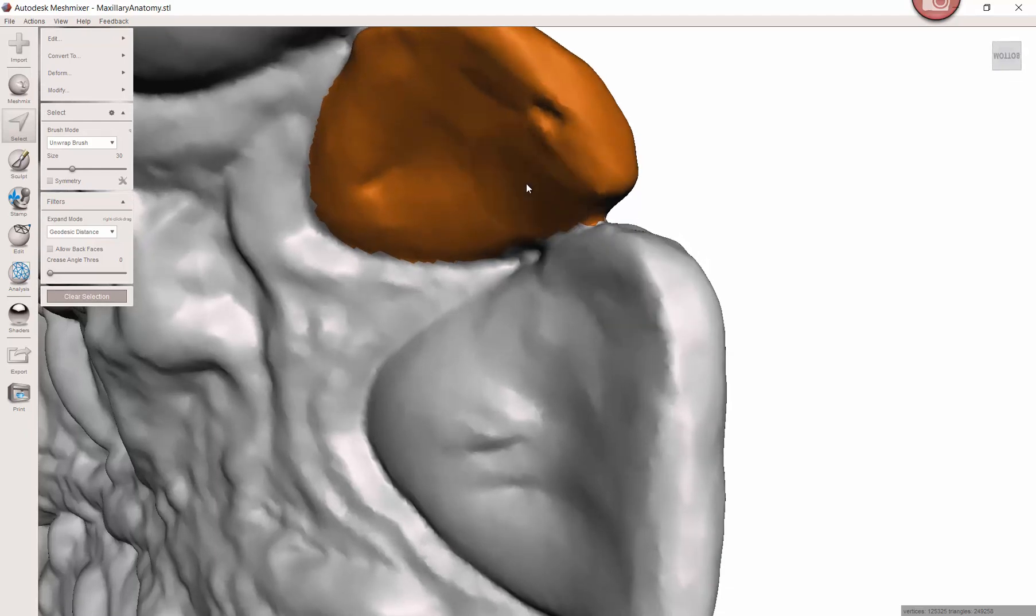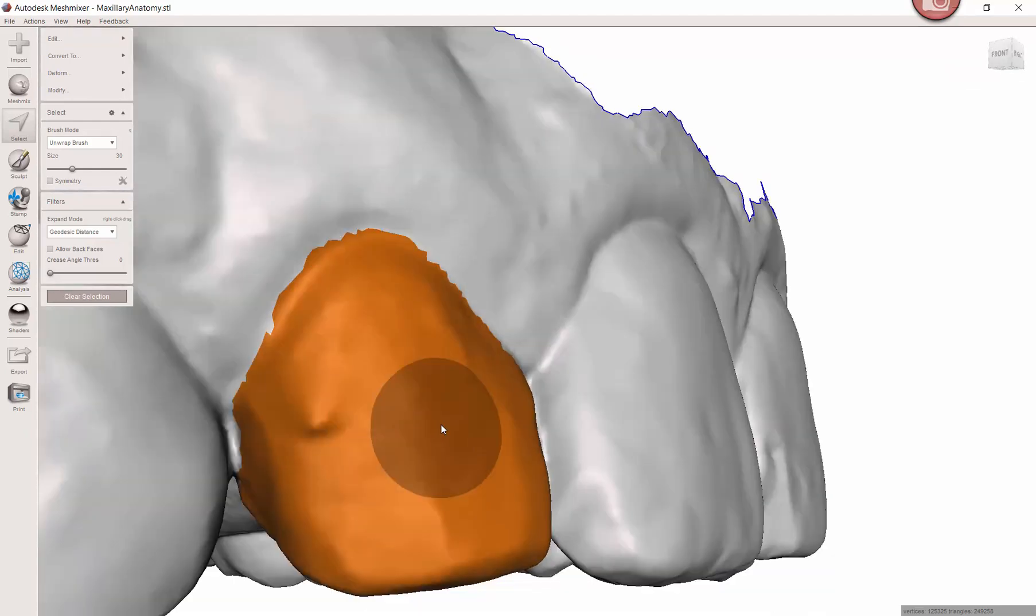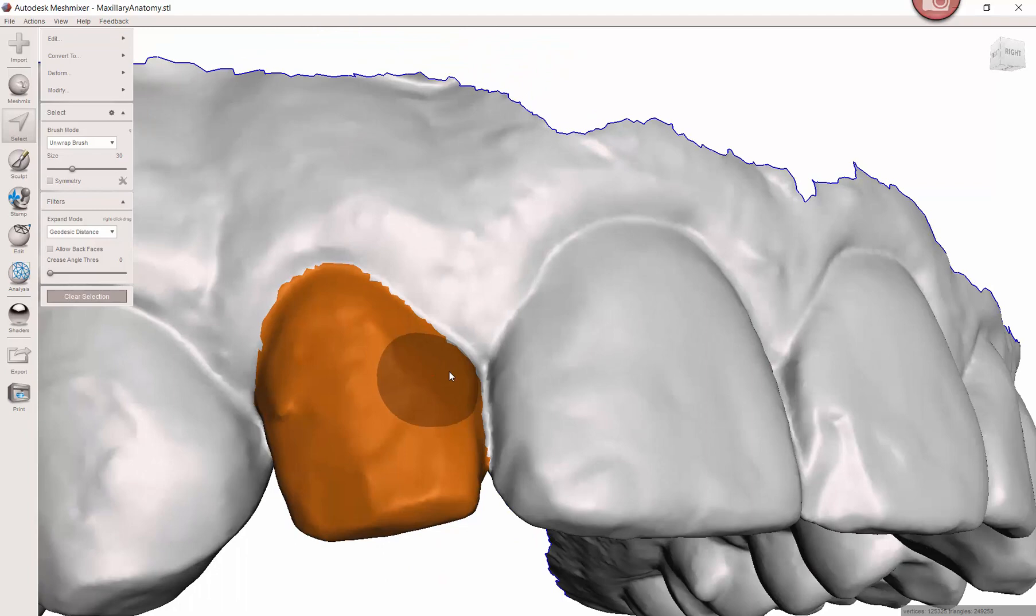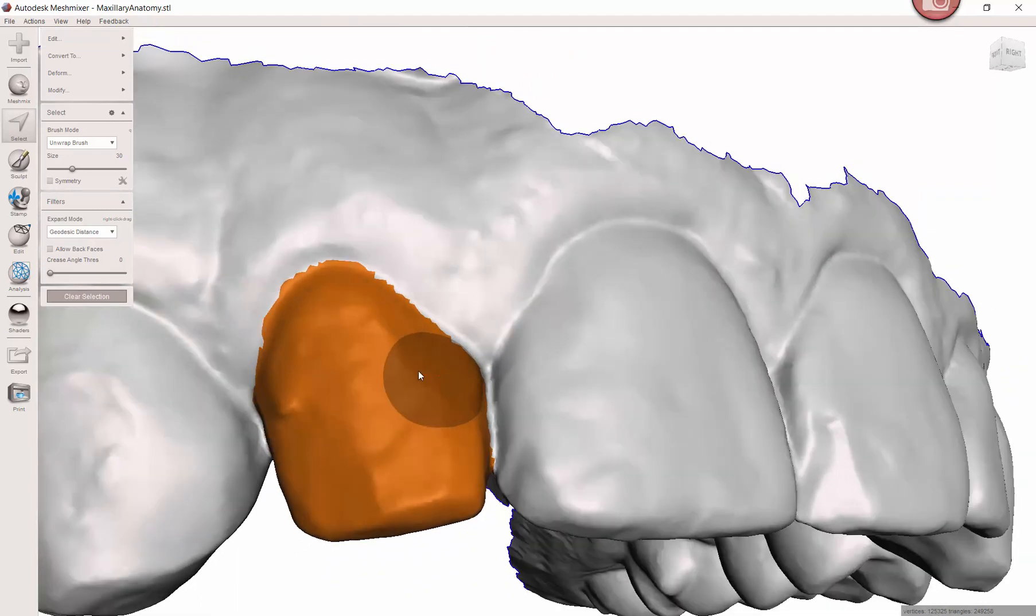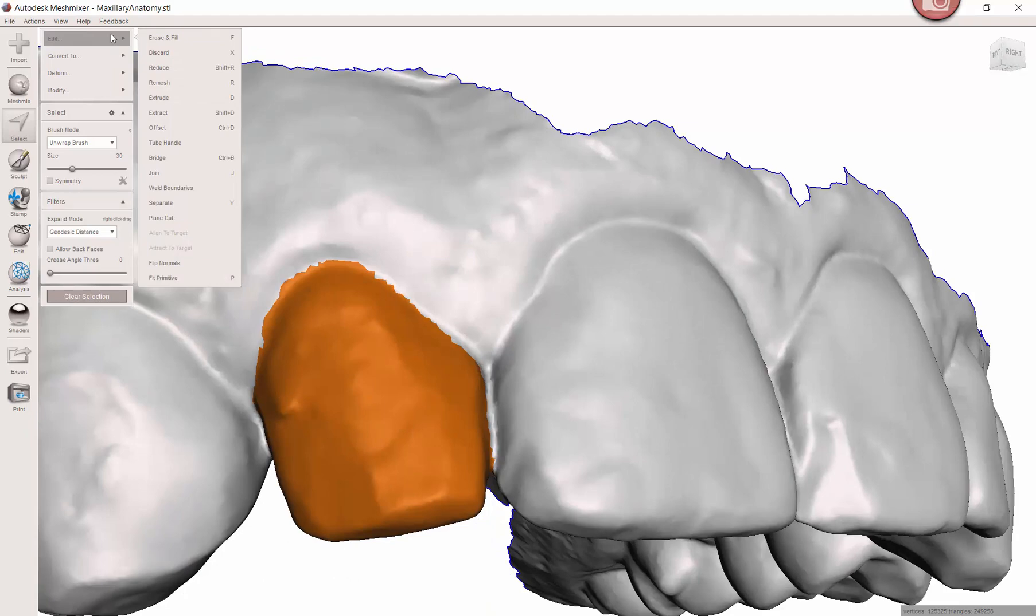Make sure I get that little triangle. Now I want to have a nice smooth extraction, so I'm just going to press the B button, which is also under modify smooth boundary.